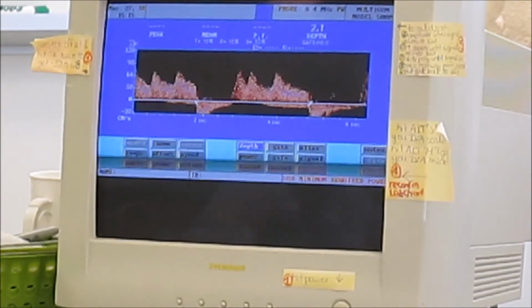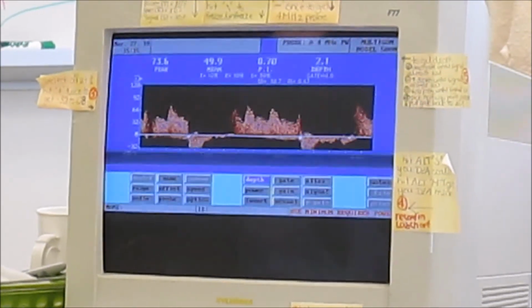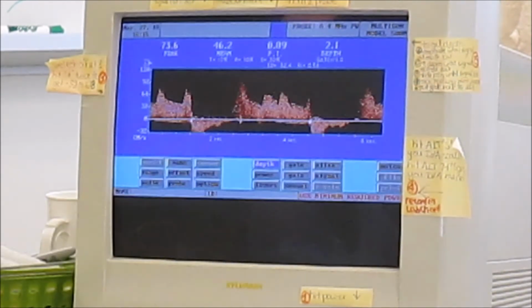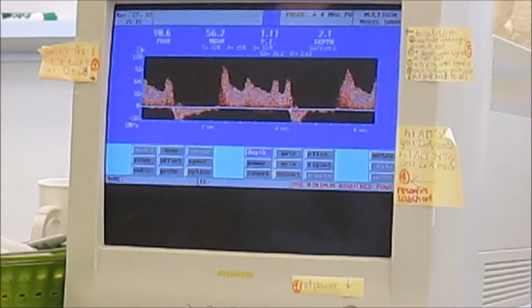Blood velocity is slowest during the actual contraction, as the maximum contraction creates the local pressure within the artery that temporarily slows the blood flow to the exercising muscle. Blood velocity is greatest between contractions, as blood is able to flow from areas of high pressure to low pressure.